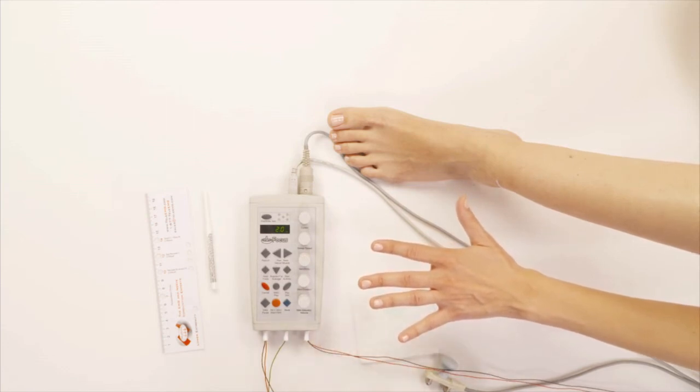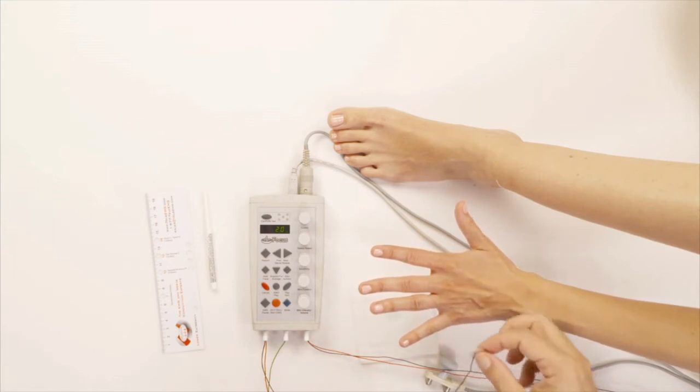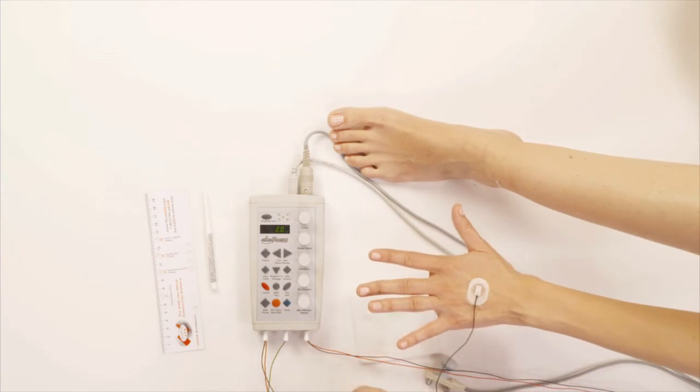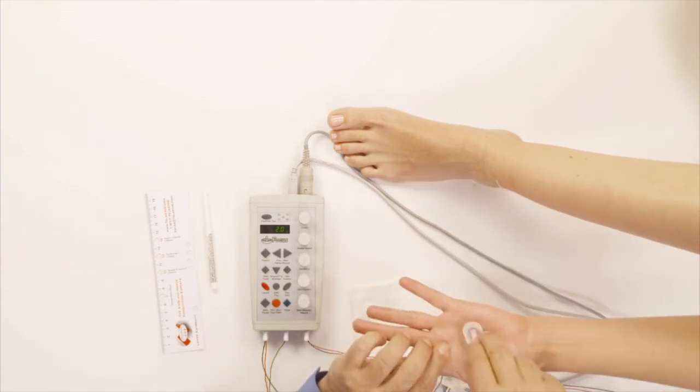So channel one electrode, we're going to put the active electrode, the black electrode, on the back of the hand like so and the reference electrode on the palm of the hand like so.